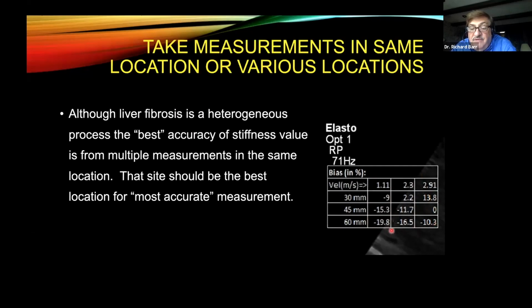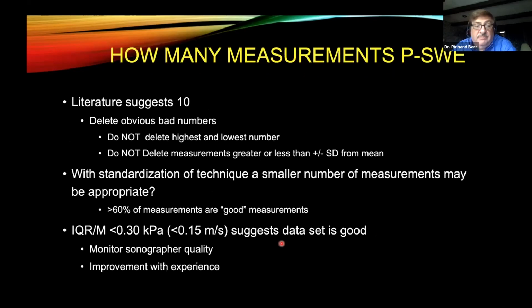So these measurements were given back to the vendors. They were able to see where they were having problems, and they've readjusted the system with appropriate factors so that these numbers are now usually less than 10% in the last round. So the variability that we see in the system, depending on where you take a measurement in the liver, can be up to 10%. And you can see that we would get more consistent results by taking the same measurements in the same location. And again, it's really depth that's important here.